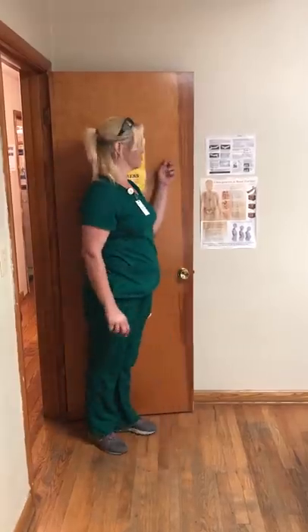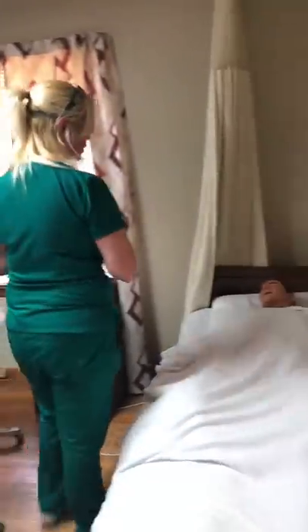This is skill number five: catheter care on a female along with hand washing. Hi, my name is Jeanette. I'll be your nurse's aide today and I'm here to help you with your catheter care.